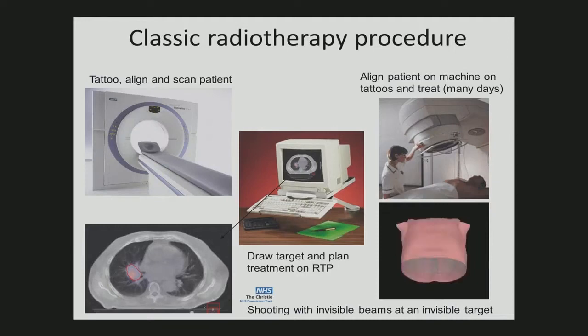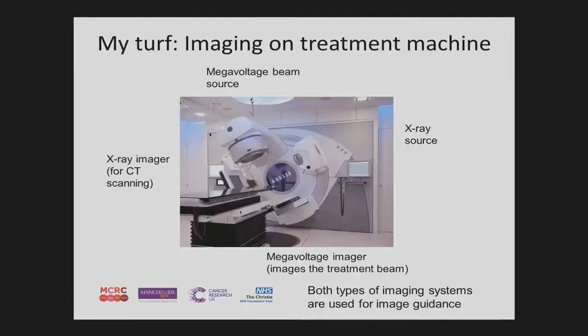And then eventually the patient is moved to a big treatment machine where those beams are actually shot at the patient. But at first you can see that there is a bit of a problem, because you're shooting with invisible beams at something that you can't see, because you can't see inside the patient unless you have a scanner. By the way, it's fine to ask questions or interrupt at any point in time.